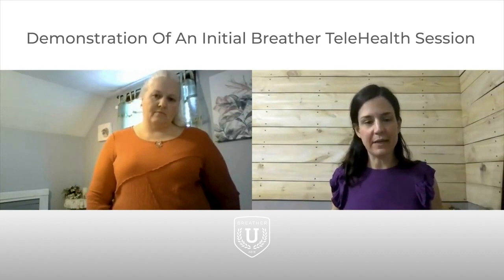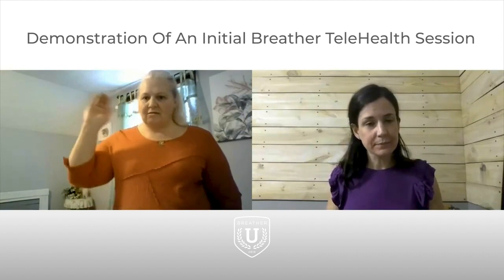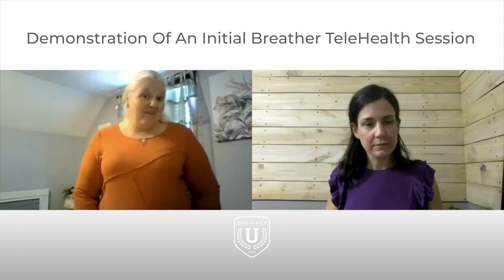Okay. But let's decide when during your day we're going to build this into your routine. I want you to do 2 sets sometime in the AM and 2 sets sometime in the PM. So what do you think would work for you? Lots of people tie it to brushing their teeth. I was thinking something in the morning that I'm going to do anyway, so brushing my teeth would work. And then in the evening, every night, I watch Young and the Restless.